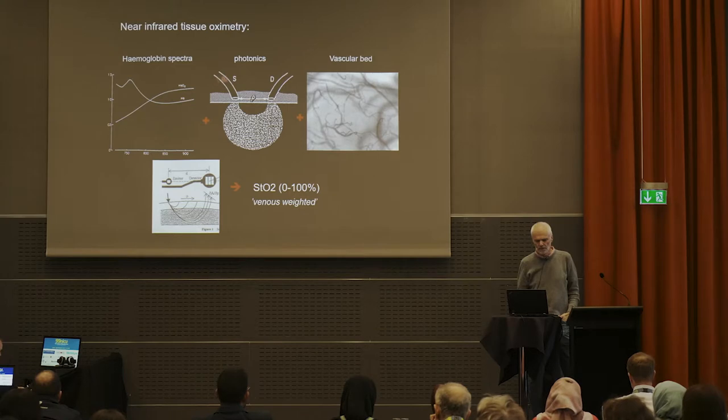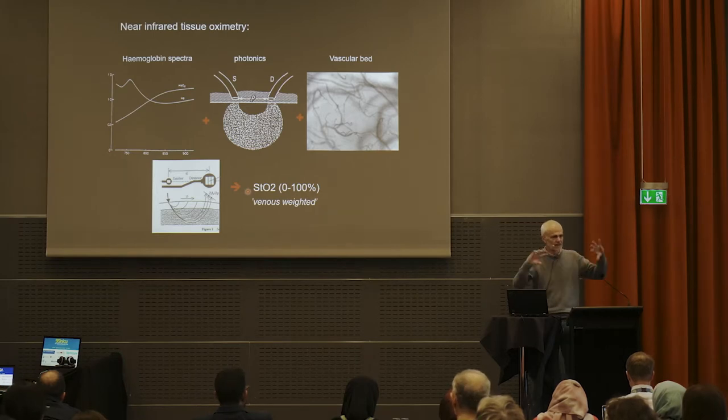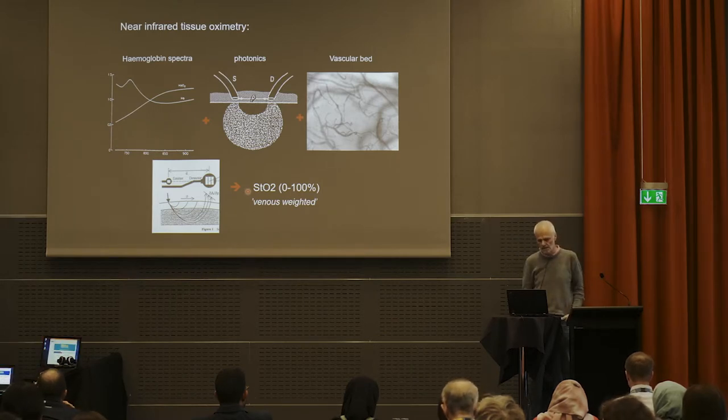So when you put down photons here at the source, photons will go into the tissue and spread around at random. Those getting too close to the surface will get lost, and therefore there's no signal from that superficial layer here. The photons detected here will statistically, typically have been to some depth and then recovered here. Those straying too far into tissue will never find their way back. So that is the reason why we have this banana-shaped area of interest, which is sitting between the source of light and the sensor, the detector of light.